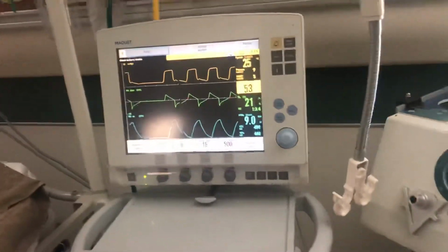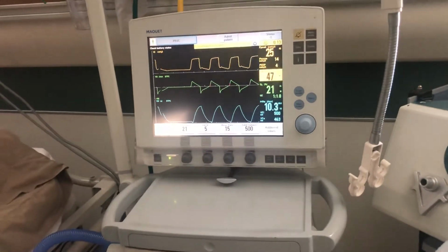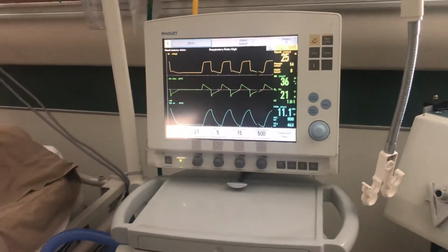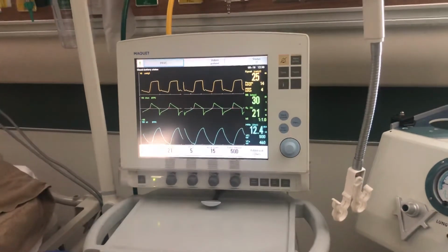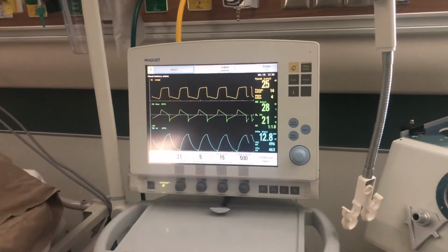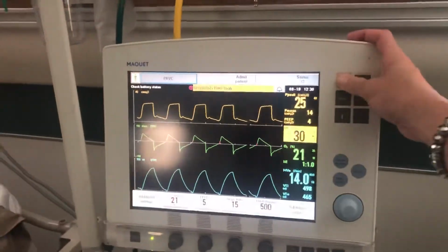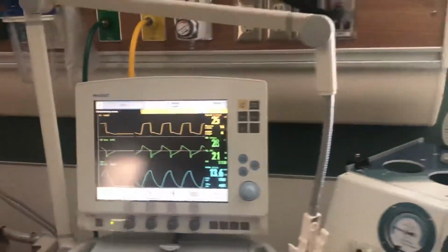And at this point, we will take that spontaneous respiratory rate of 65 and that total minute ventilation of 7.8, and you would do 7.8 divided by 65, and whatever tidal volume you get is what you will use in your calculation for RSBI. Then you would take that 65 divided by the tidal volume in liters, and that would give you your true RSBI, okay? And then you would give me the RSBI total on your ventilator sheet.